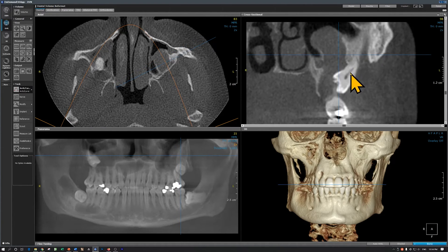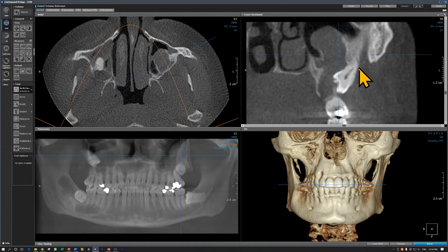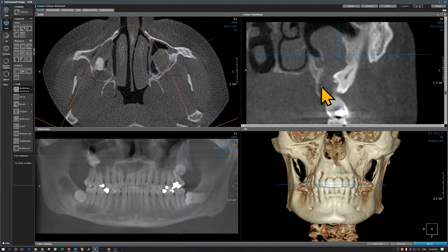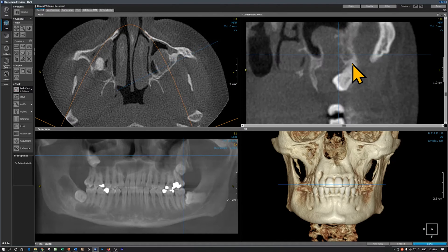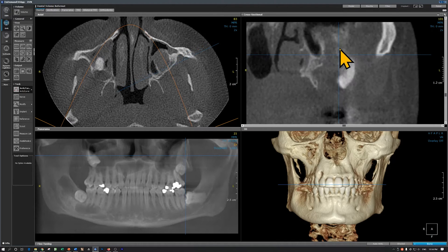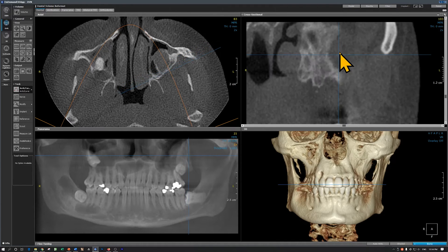The third molar is impacted and palatally oriented. The root of the third molar is in contact with the buccal cortical plate. This is the long odontogenic keratocyst without much expansion on the buccal or on the lingual, although it is elongated. That's the odontogenic keratocyst. I'm going to move to the mandibular region.